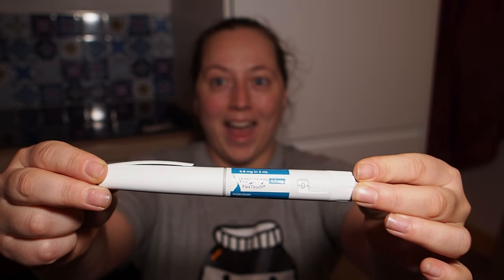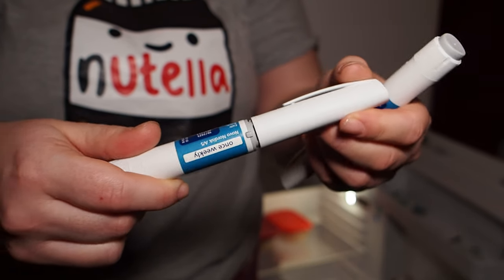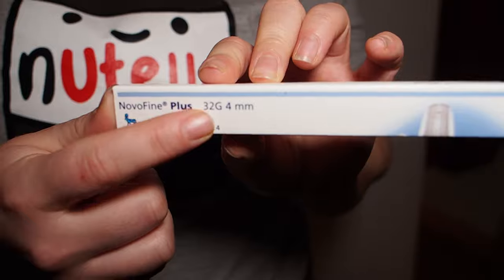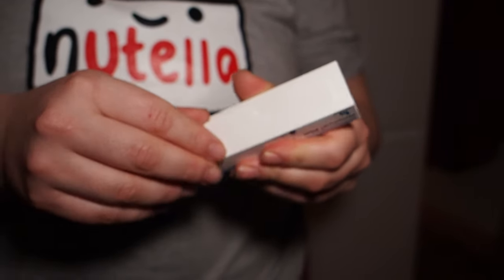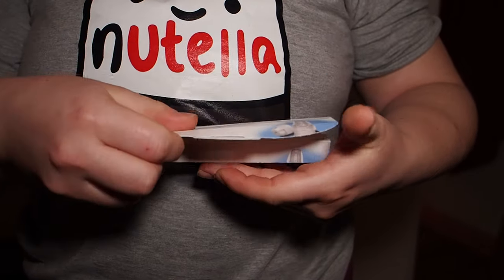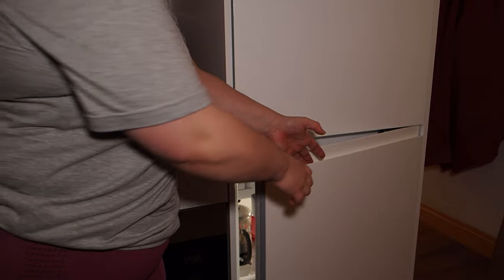Hello, today I'm going to teach you how to inject any GLP-1 medication safely and correctly from an auto-injector pen. Here are the needles — they are four millimeter and they fit onto the pen directly. I'm just going to get a new one out of the box. You have to get a new one every time you inject, whether that's every day or every week. You should be using a new one mainly for hygiene reasons.